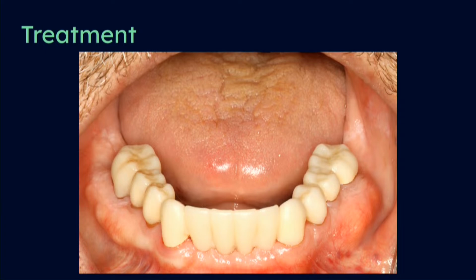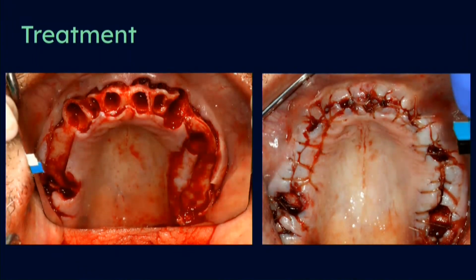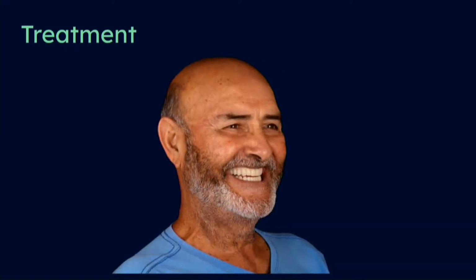This resulted in a mandible that represents a harmonious occlusal plane and that is ready to receive the maxillary complete denture for function. So the teeth were extracted and the immediate denture delivered to the patient. Patient was very happy with the result at his 24-hour follow-up. At this time, several improvements could be achieved on his aesthetic result, as well as related to occlusal vertical dimension, as I have noted in the patient's follow-up. Prior to moving to the patient's definitive treatment, another iteration of the maxillary denture was designed and delivered to improve occlusal vertical dimension and to drive the design of his final denture.